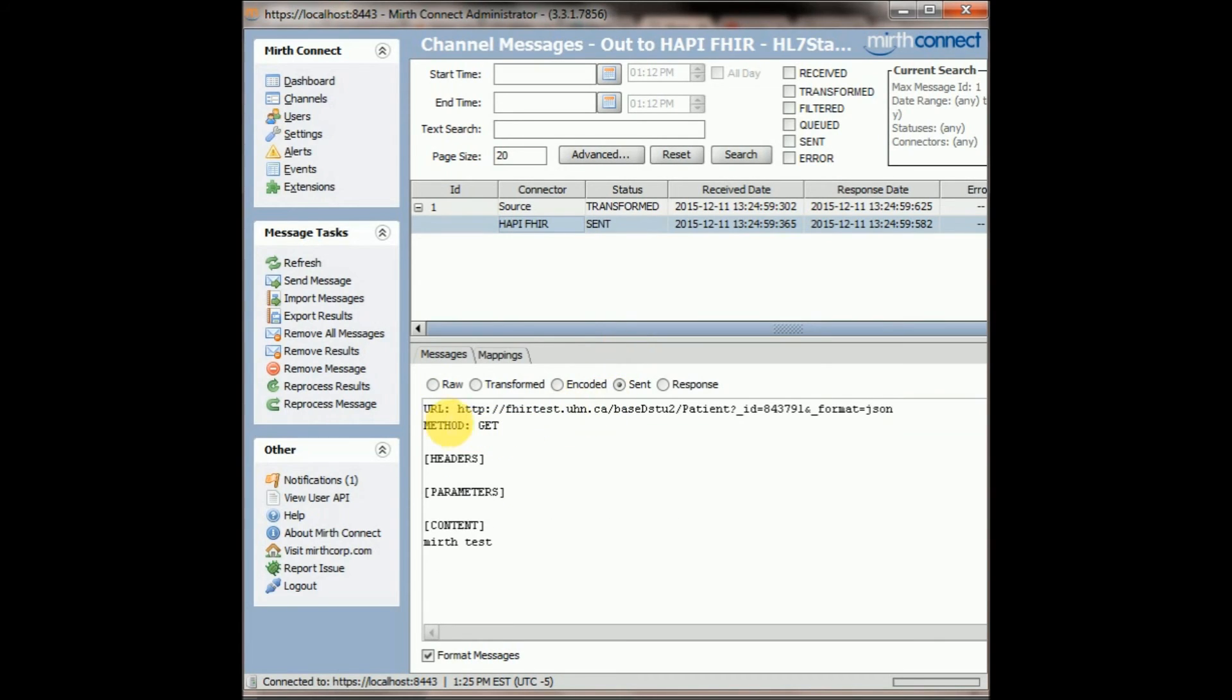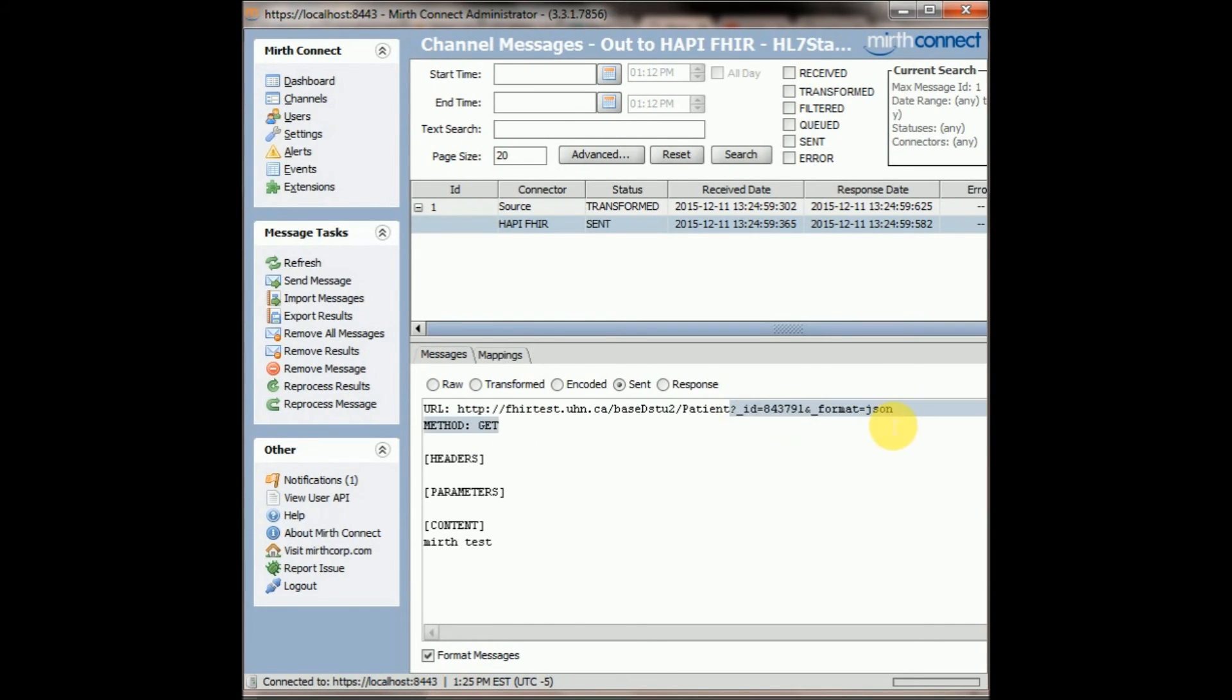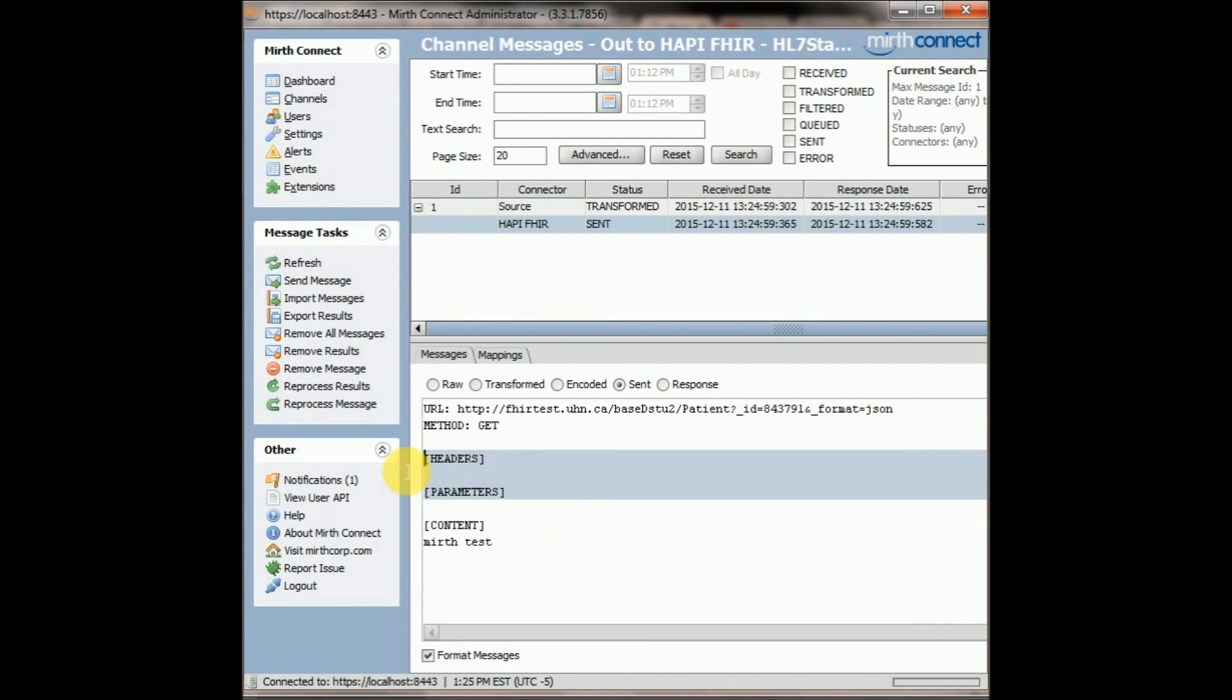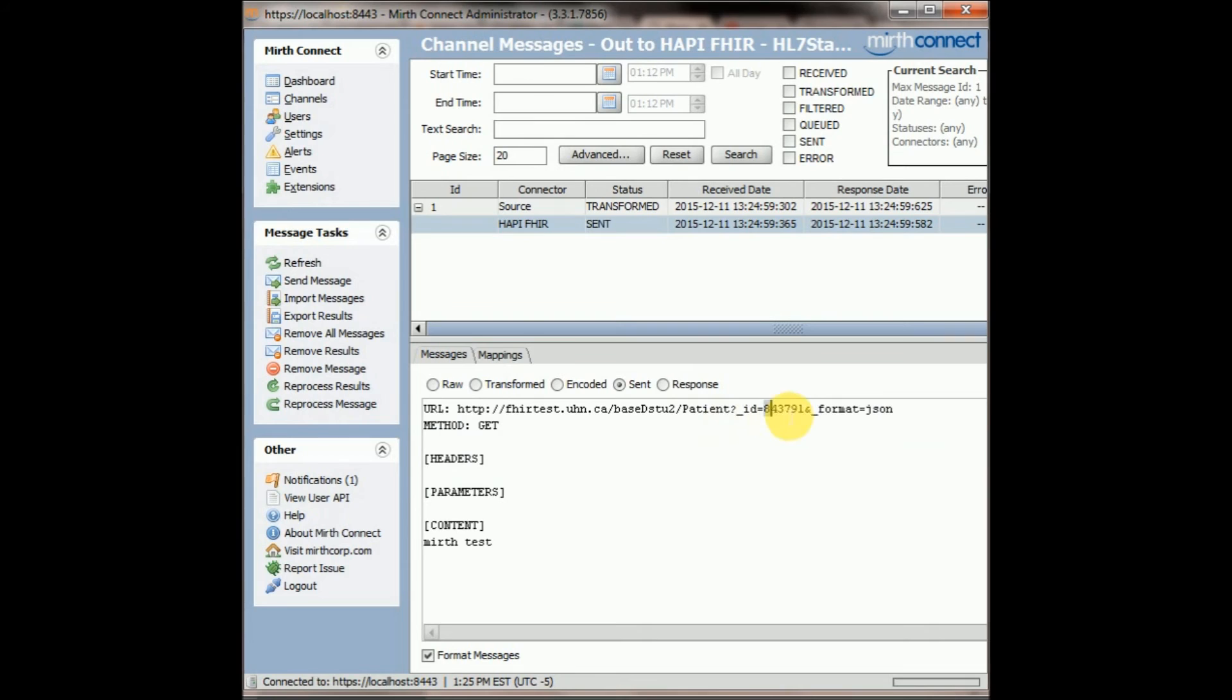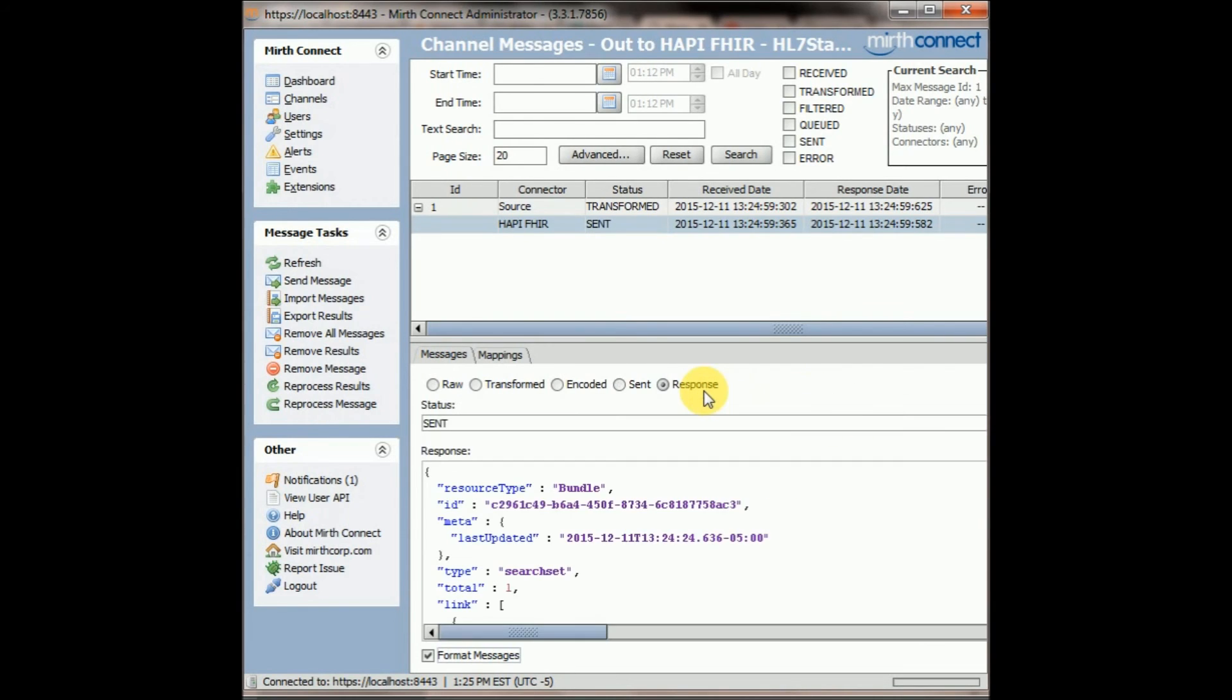Fantastic, so in our HTTP sender we had a get command with this URL, here's our ID, didn't have any parameters, there were no headers, and then let's see what this server sent back. Hopefully it was just information about this particular patient ID in a JSON format.